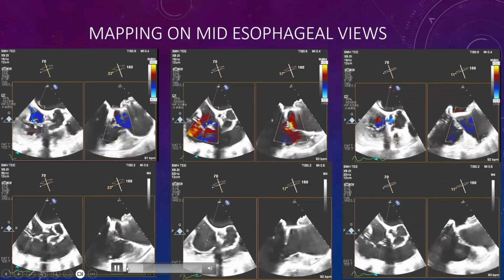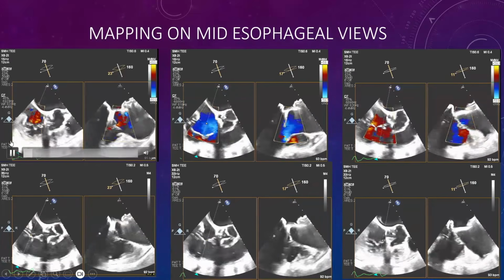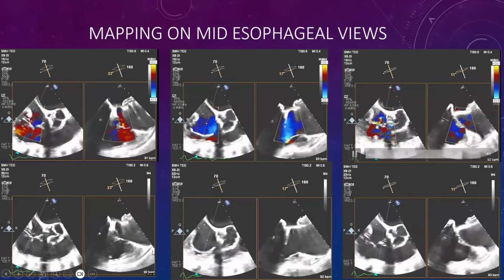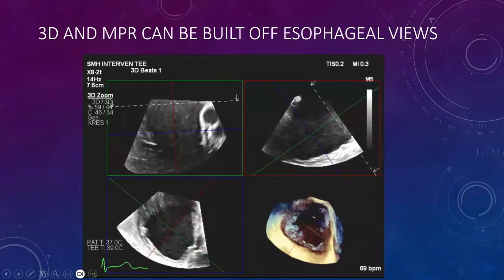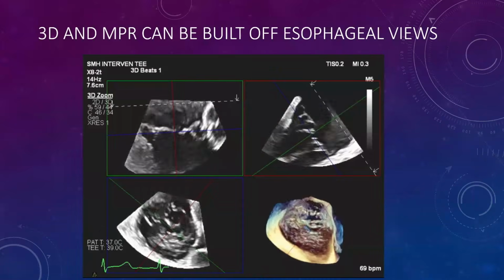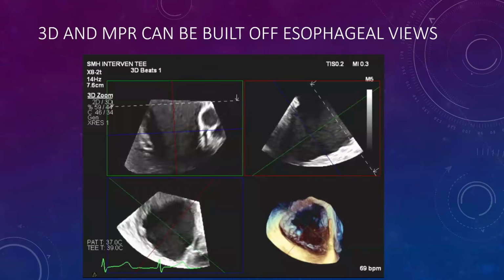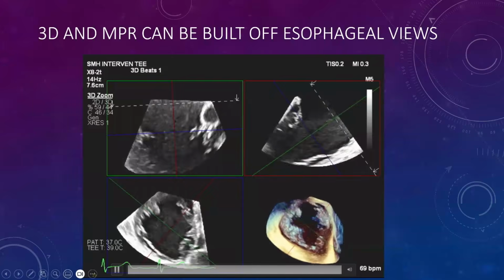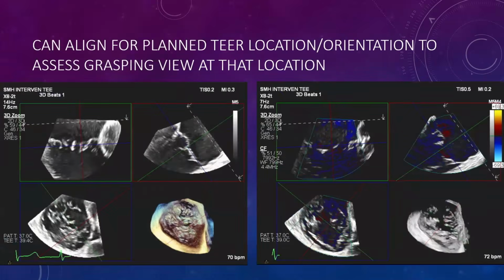So we, again, could do this in the mid-esophageal views, where we're more like the typical views that we saw earlier. Again, looking at the posterior septal commissure, more centrally, and then anteroseptally at both 2D and color. And then in the era of 3D, we will be doing 3D on all of these patients, both from an understanding of the anatomy perspective better, as well as in terms of looking at all of the structures and the function, and this can be done with and without color.